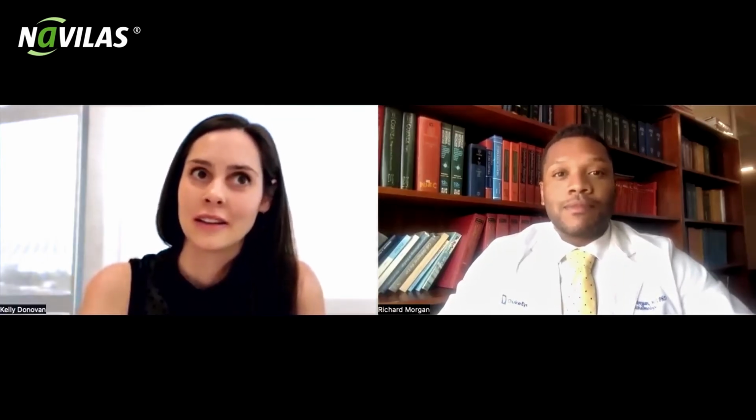Yeah. I think it has a lot of educational benefits, as well as truly functional benefits in clinic. As I said, I think the duration of treatment has been the biggest advantage for the Navilas, especially with patients who need pan-retinal photocoagulation. And then in terms of training, just the hands-on learning for looking at the retina, identifying the areas of treatment, planning where you're going to put laser, where you're not going to put laser, and then actually executing it. I think it has been really great in general for us.